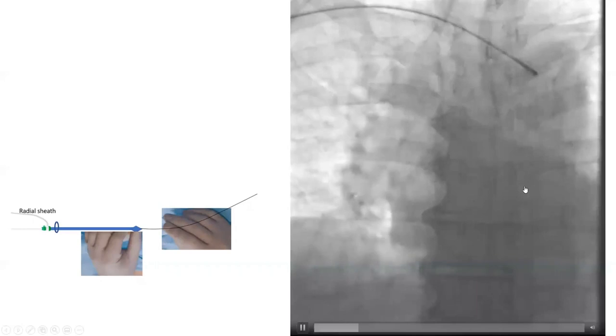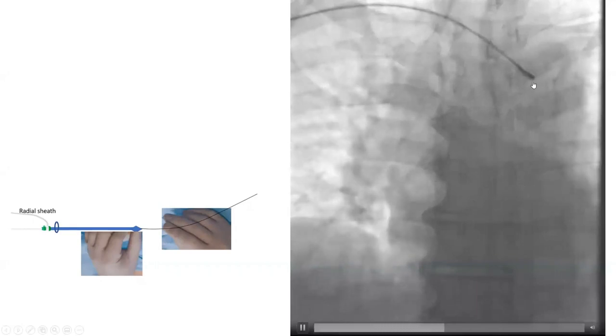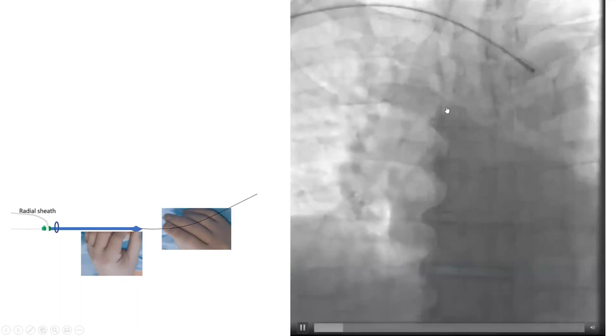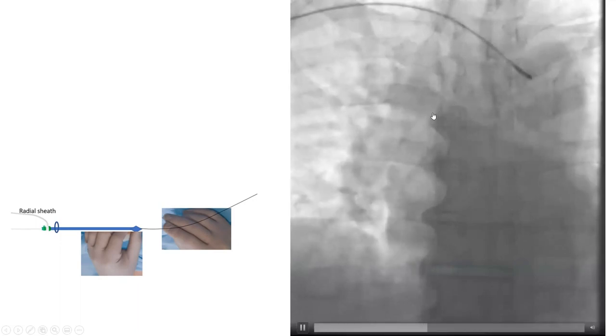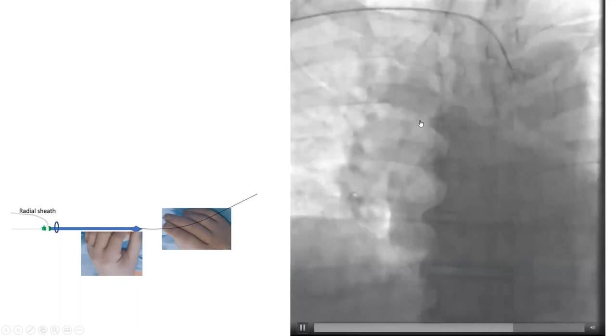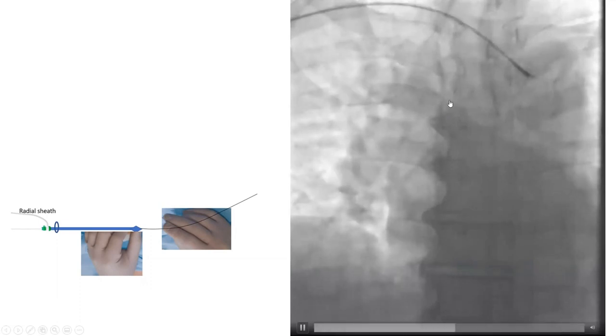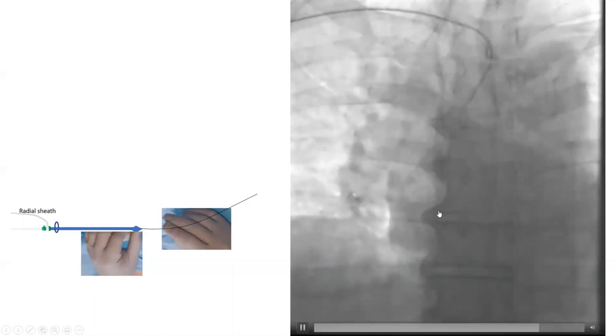Here is an illustration of it. We pull the wire, then we're pulling the catheter from descending into the arch with a counter-clock, and the catheter will fall into the ascending aorta. Once the catheter falls into the ascending aorta, you re-advance the wire and loop it over the valve.